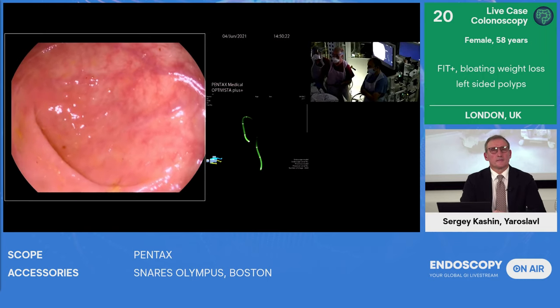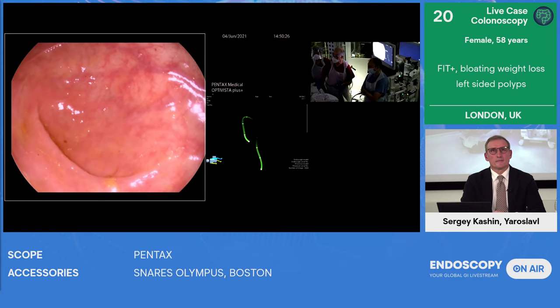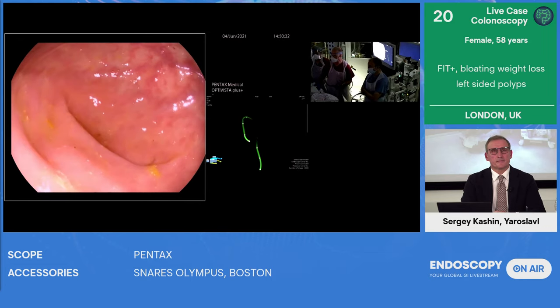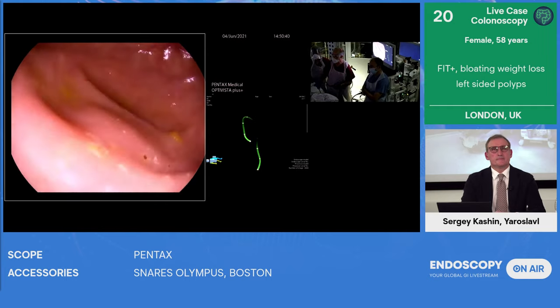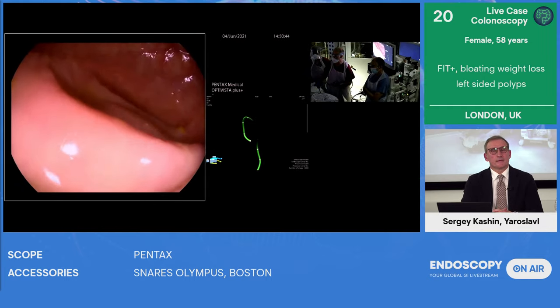Nice and normal. This is an area where you quite often get serrated pathology, sessile serrated polyps, but there's no abnormality there. We're using the Discovery AI system from Pentax. So you may well see a blue sort of square coming up occasionally if we see a polyp. I'm just going to pull back a fraction now.